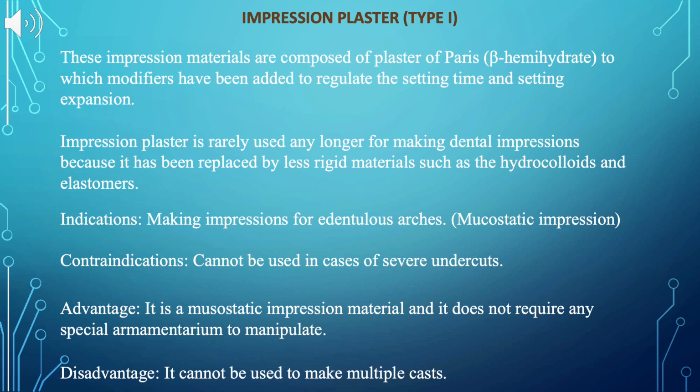Impression plaster is rarely used any longer for making dental impressions because it has been replaced by less rigid materials such as the hydrocolloids and elastomers.